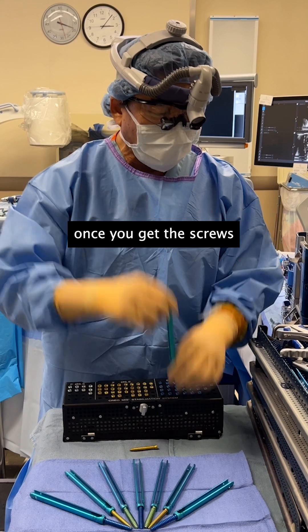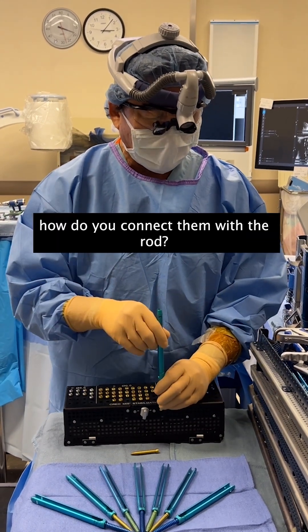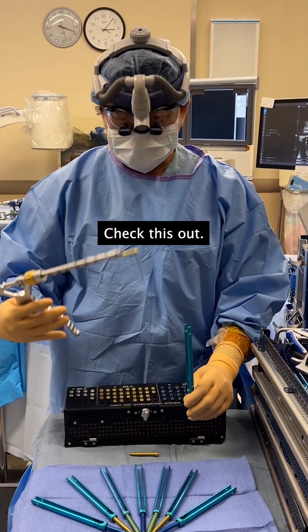You're probably wondering: once you get the screws in through those little poke holes, how do you connect them with the rod? Check this out.